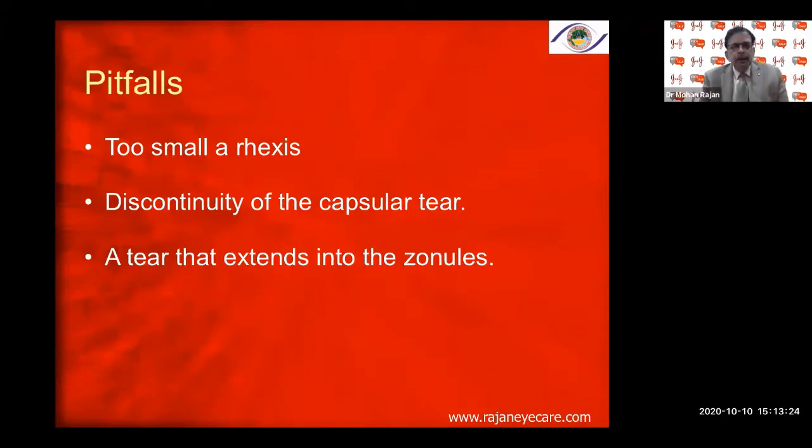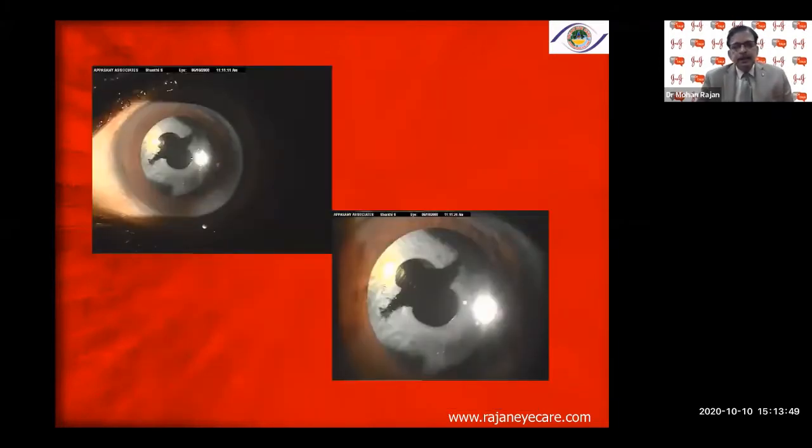If the tear extends to the zonules beyond 7 millimeters, that is dangerous. A very small rhexis can lead to capsular phimosis, which can progress rapidly post-operatively, causing folding of the lens, backward shift of the lens, and a hyperopic shift. In one such case, I had to do laser capsulotomy on both sides to relieve the capsular phimosis.